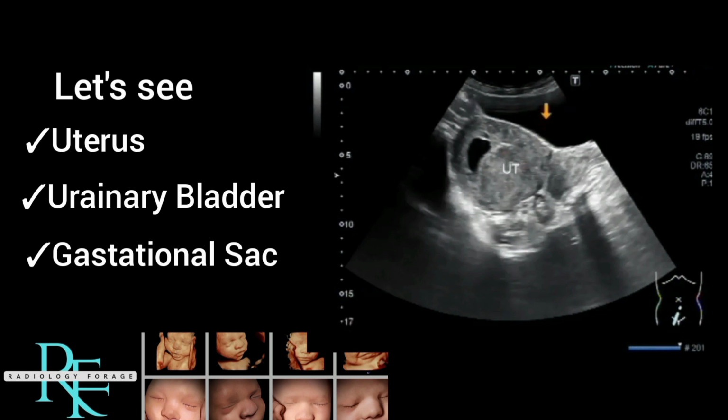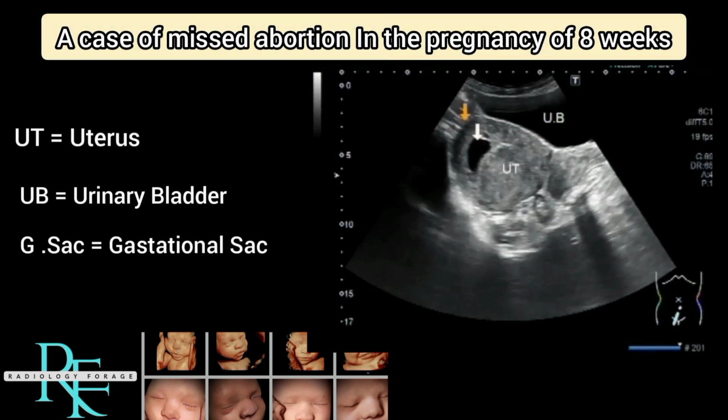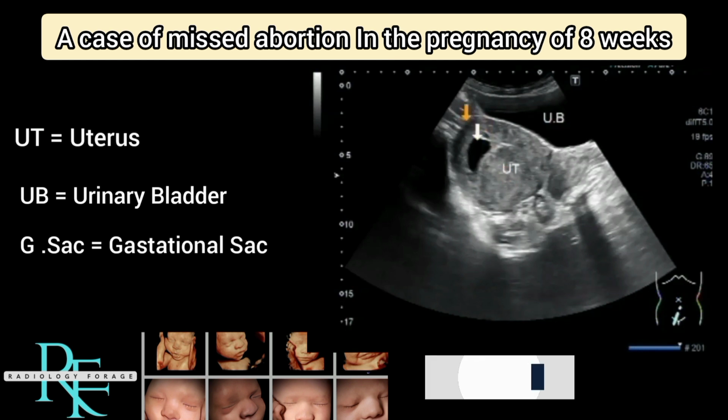This is uterus and this is urinary bladder and this is gestational sac. You can see it very clearly, urinary bladder, uterus and gestational sac. One by one I have marked it.